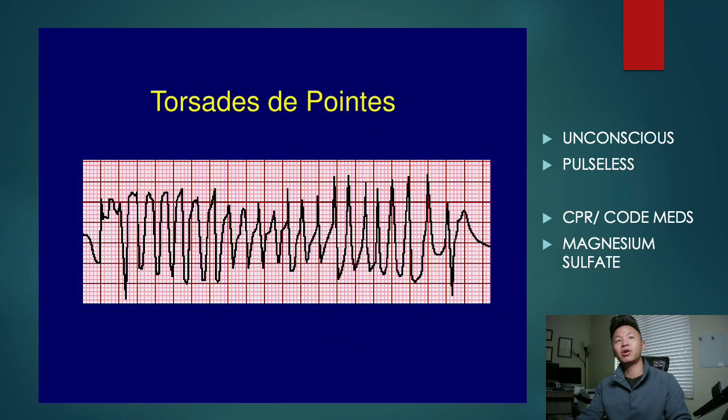All right, this is called torsades. Torsades is a waveform that looks like a giant waveform that goes smaller, bigger, smaller. It's like a peristaltic type of waveform. If you see this in the peristaltic motion, just remember the only fix is magnesium sulfate, IV magnesium. That is it. That's your main answer there.